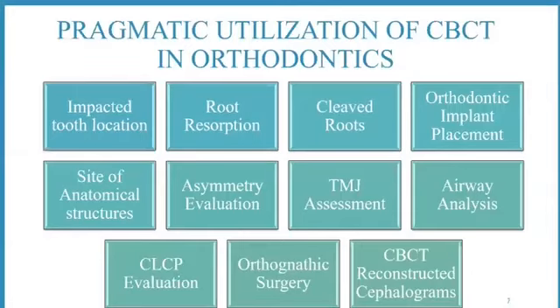In many of my own and my batchmates' cases, I've noticed that the treatment plan with conventional radiographs was completely different from after the CBCT evaluation. It is surprising that the little details added by the CBCT image can provide vital information which can change the course of the orthodontic treatment completely. And also, this information helps us in better risk assessment to keep the patient well informed about the planned procedure. Now let us look one by one in detail how CBCT is helping us.